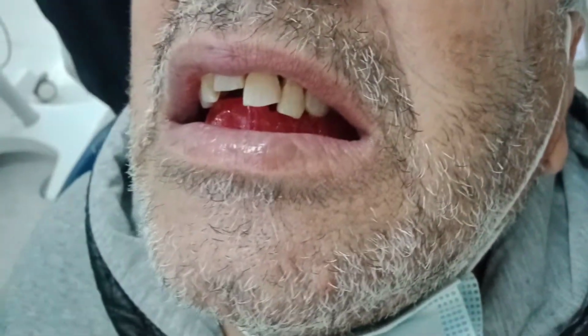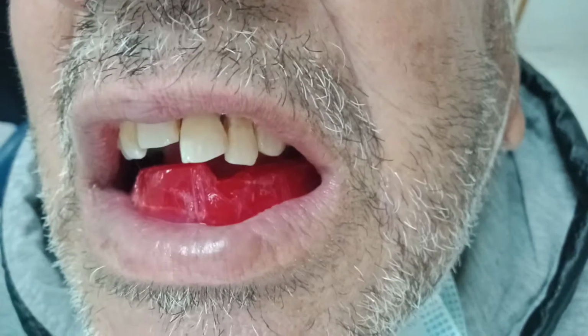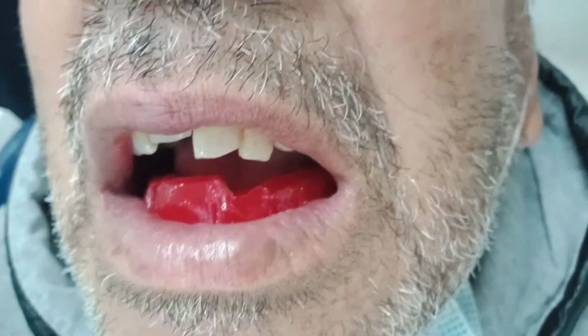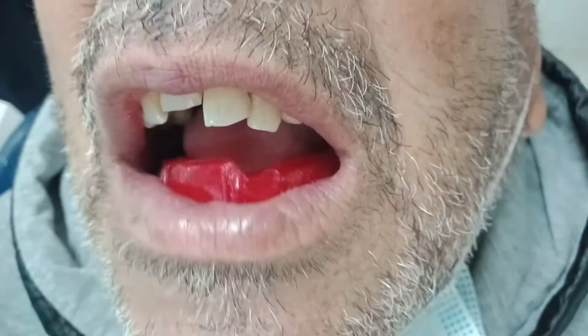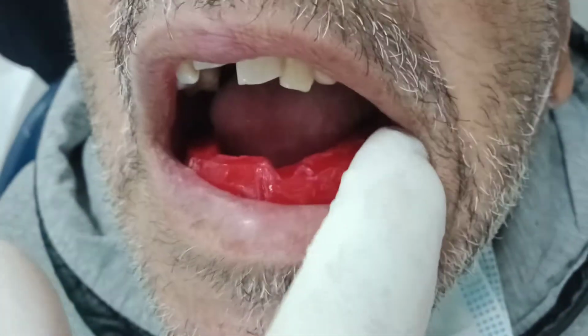Now, my question was, how are you going to record this and send it to the lab? What options do you have? Can I do it in wax? No opposing. Because the upper teeth are present, there is no opposing wax, so you were not thinking about the same ways we were thinking in when complete denture patients are there, because we have wax opposite to wax in complete denture patients. This is a single denture. So how am I going to take the bite?